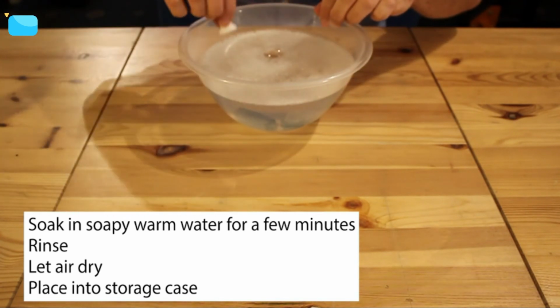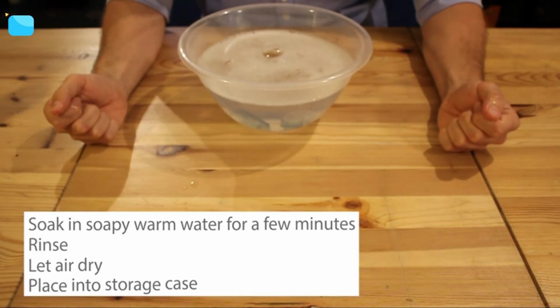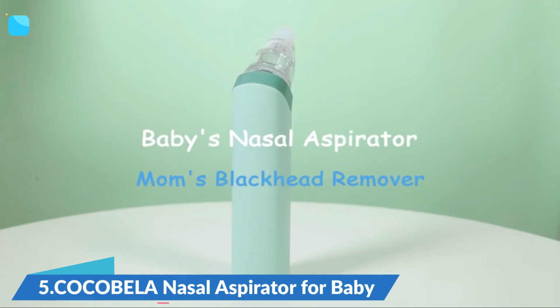Then you take your storage tank and attach it to the body. You push it firmly against it and then turn clockwise. You should feel it lock into place, there should be no wobble. And then you're ready to go.